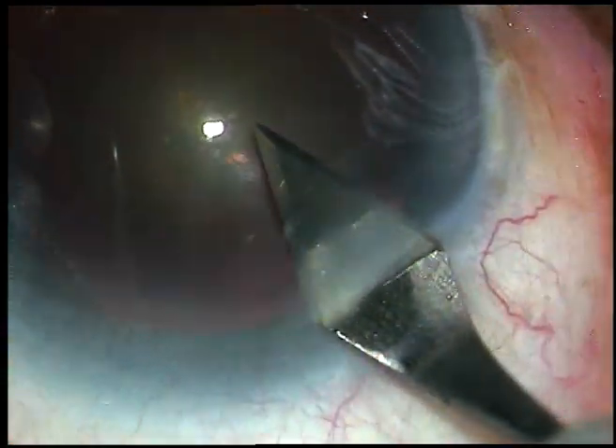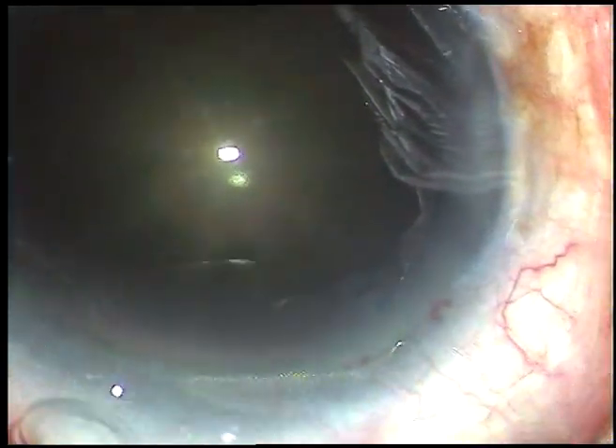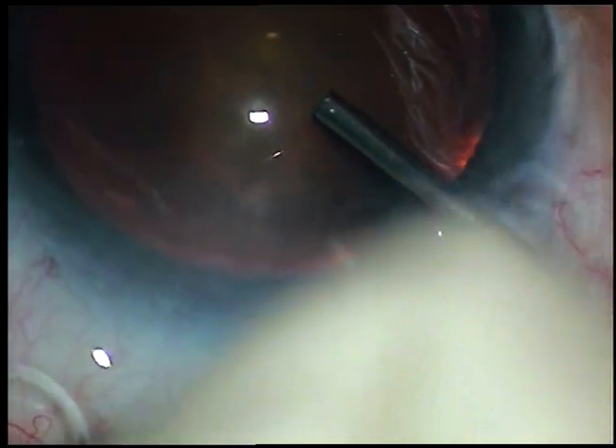This is the main incision — a 2.8 mm incision. Now, viscoelastic substance, 2% hydroxypropyl methylcellulose, is injected into the anterior chamber.